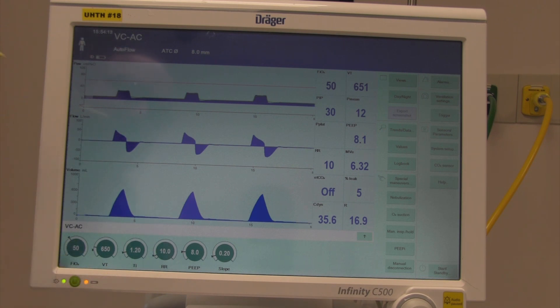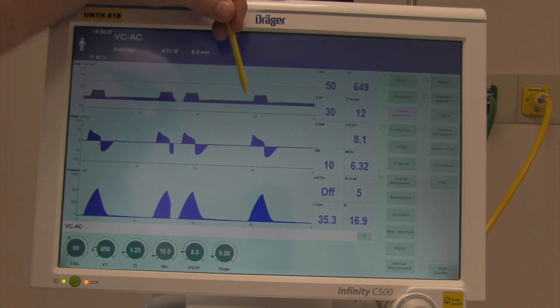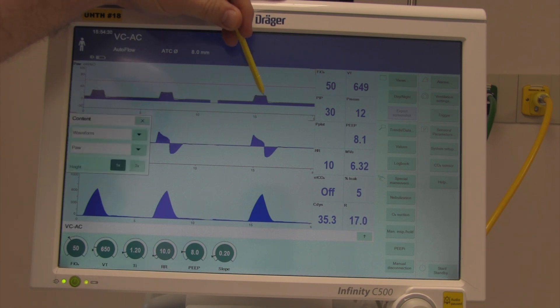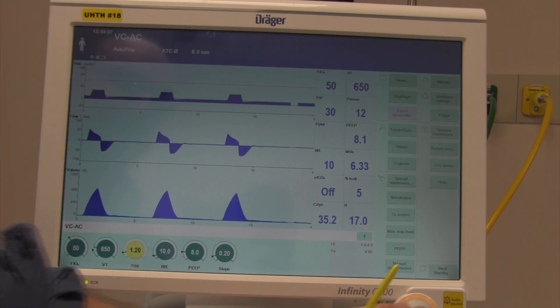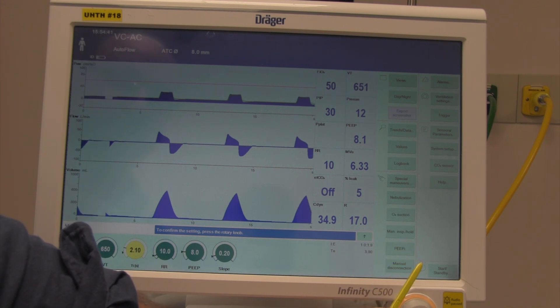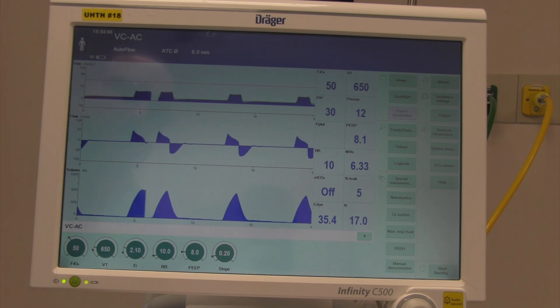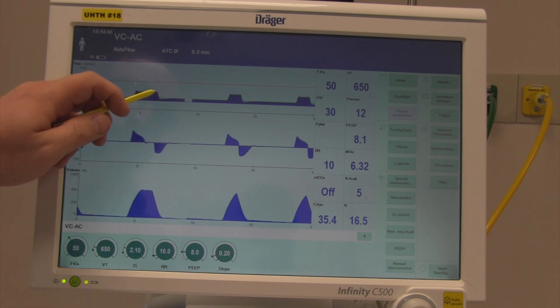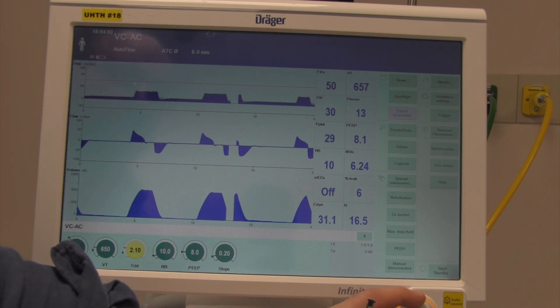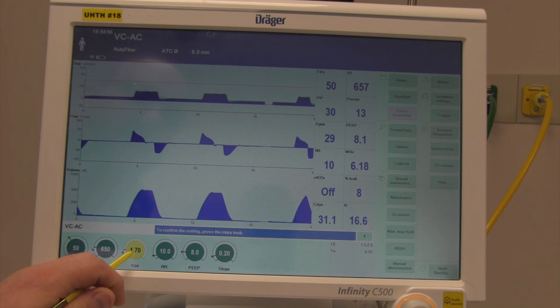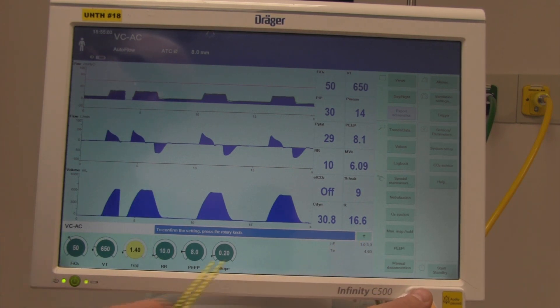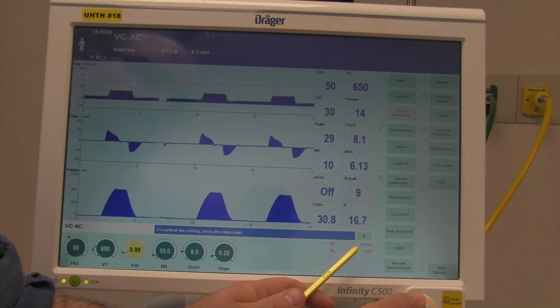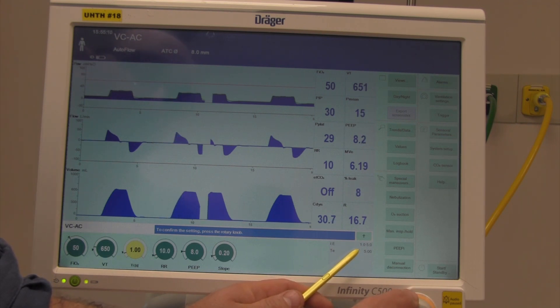Ti is usually manipulated based on lung dynamics — it's the inspiratory time from breath start to end. If I make Ti longer, you can see it extends to 2.1 seconds. Normally we manipulate Ti to set the I:E ratio. As I decrease my Ti, the I:E ratio gets longer. This is my I:E ratio as long as the patient is receiving ventilator breaths.